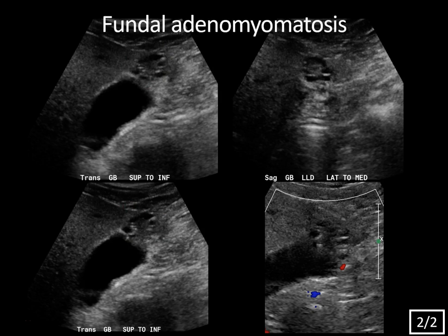You may be thinking, wait a minute — Dr. Koval, you need comet-tail artifact to diagnose adenomyomatosis. Well, sometimes you can diagnose it without the artifact, because adenomyomatosis is actually mucosal thickening and herniation into the gallbladder wall, which causes these little cystic areas to develop — known as Rokitansky-Aschoff sinuses. And then secondarily, cholesterol crystals can deposit into the sinuses, and that's what will cause the characteristic comet-tail artifact that we look for in adenomyomatosis.